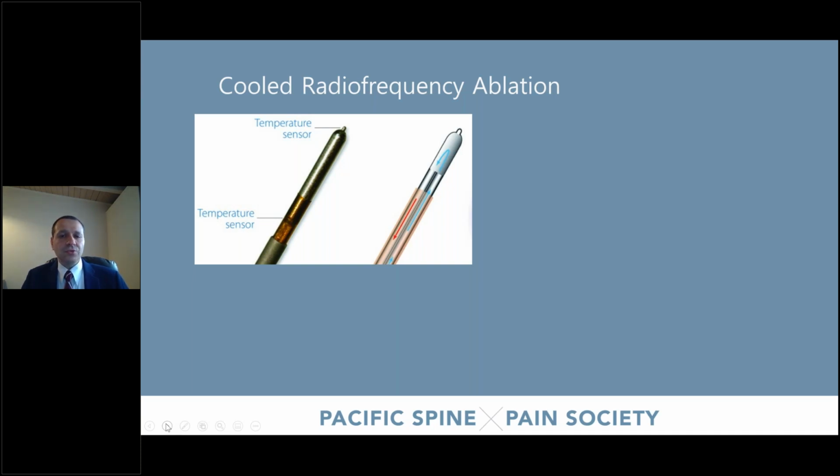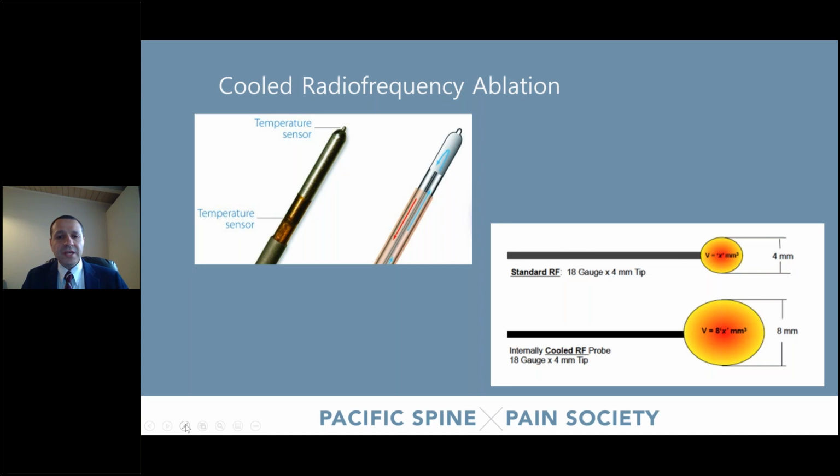Why do we even use the word cooled? I mentioned that the mechanism that we are using is heat, but at some point your heat is not what is helping you. The heat is something that is limiting you at some point. So next time that you're doing a radiofrequency treatment, please do me a favor. Look at the energy output of your machine. You see that at the beginning, when you're starting your treatment, the energy output of your machine is around 40 volts or so. And as you go on through your treatment, as the temperature stabilizes, your energy output drops down. Because what happens is that at that point, the needle tip is where you read the temperature. The machine does not want to make it hotter. And that is why it decreases the energy delivery to maintain that temperature that you have.